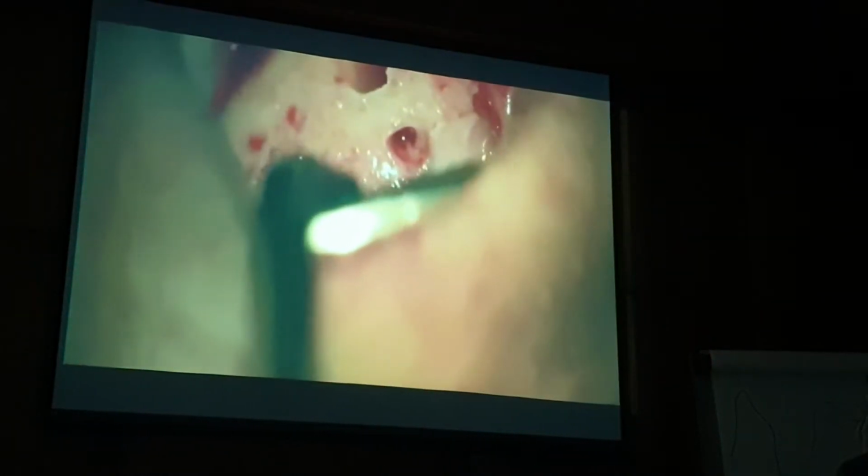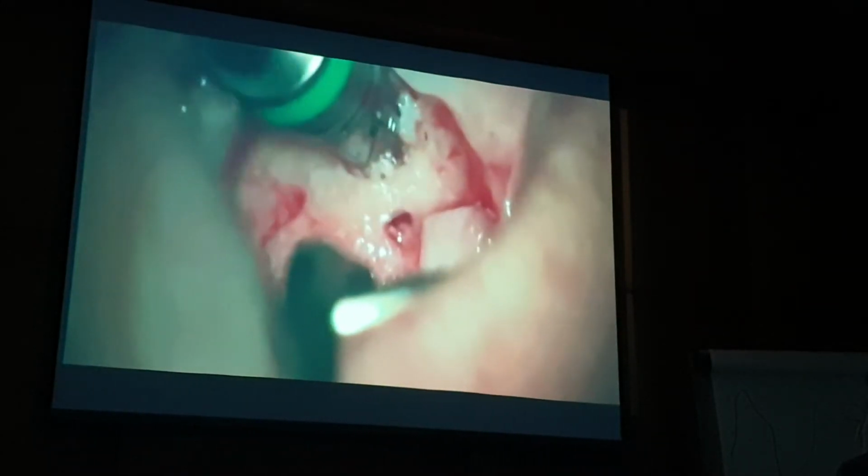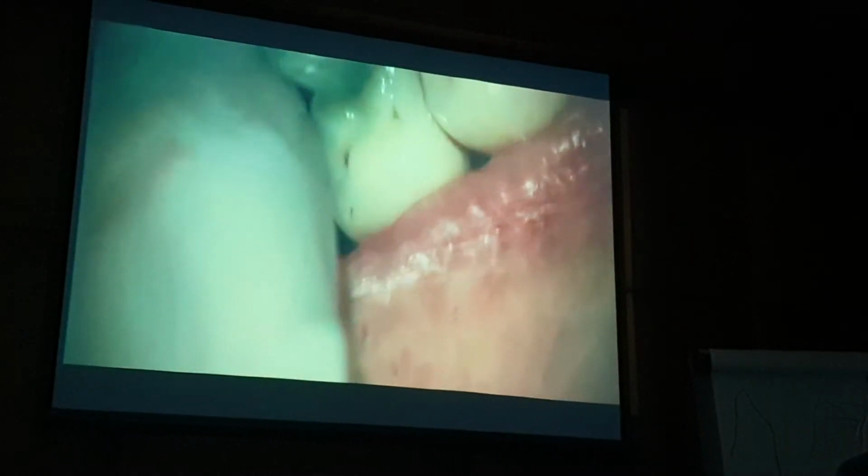So the screws are a guide for the bone? Yes. Look at the vascularity. Now I'm going to put a 6 millimeter drill with 3 millimeters of bone on either side. And when I remove the drill, look at the vascularity of this grafted site. It cuts like D2 bone, it's amazing. Look at the bleeding from that grafted site. That is what I want to see.